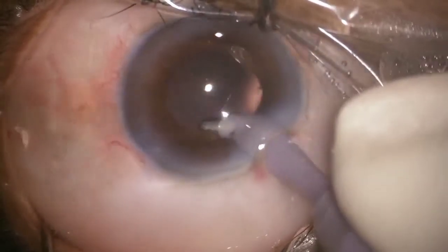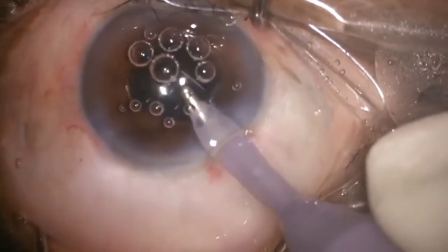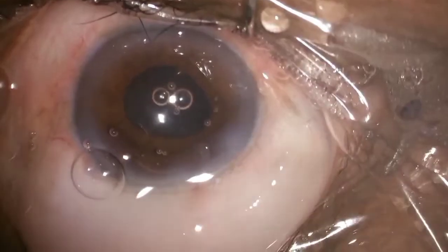After cleaning the entire cortex and visco, I did the last polishing wash. And after cleaning the entire part, I decided to close the case.